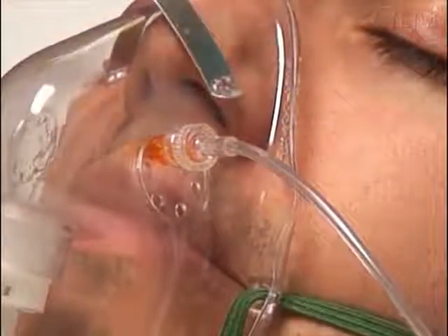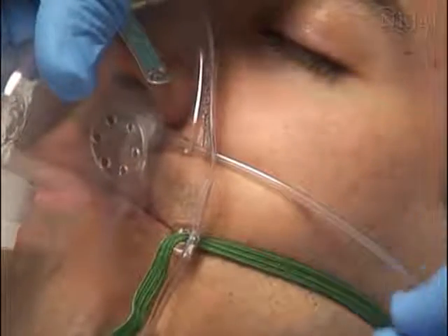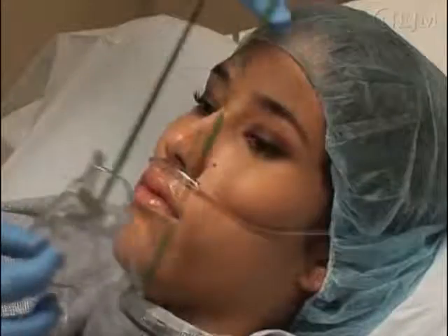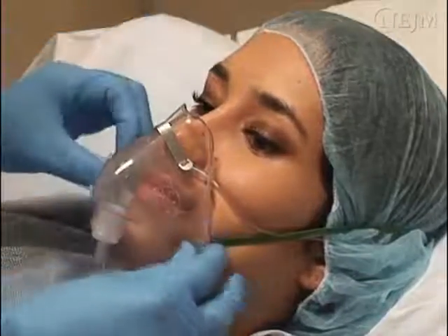You can modify standard face masks by attaching the sampling line directly to the orifice of a mask, or by securing the sampling line inside the mask. Take care that the orifice does not rest against the patient's skin to avoid occlusion of the flow of gas into the sampling line. Alternatively, you can place an integrated sampling nasal cannula underneath a face mask.